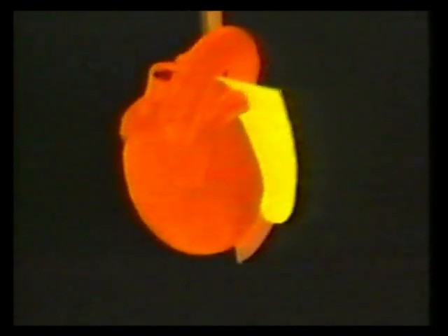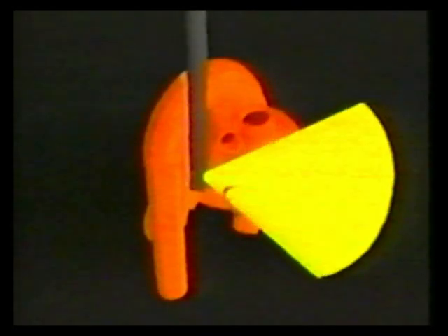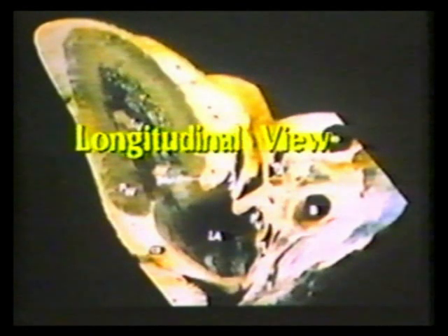Going full lateral, the transducer can be carried off through the pulmonary veins to the descending thoracic aorta. On the right side of the heart, when the scan is carried off the heart, it images the right pulmonary veins. This specimen has been cut in the longitudinal view.